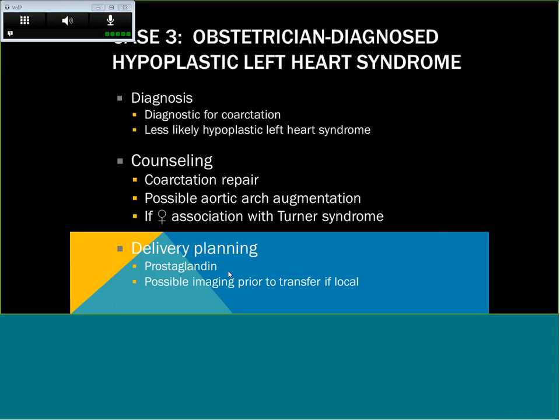So the coarctation of the aorta resulted in the simulation of hypoplastic left heart, basically. Yeah, any time that there's inadequate anterograde flow to the transverse arch, you will often see that retrograde flow in the ductal arch.